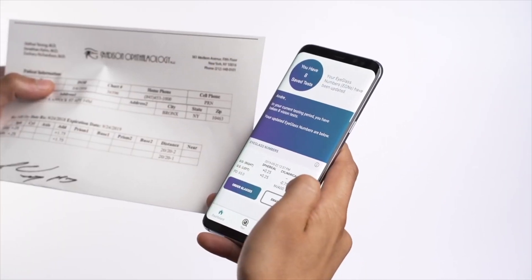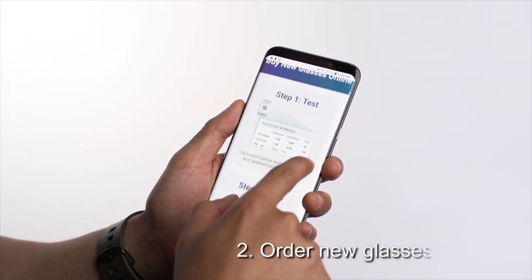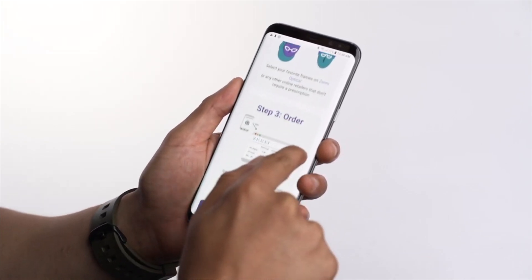At the end of the test you'll be given a set of numbers that you can use to order your very own set of prescription glasses. You can get prescription glasses online with the score you get from the test, which is great because you're not having to go out of your house or go into a store — you can actually order those glasses online.